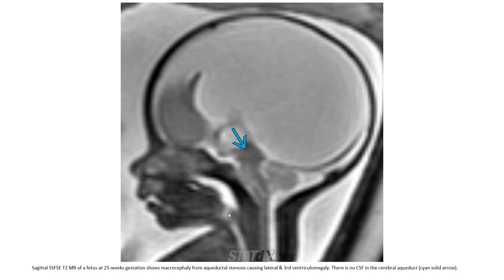This is the sagittal T2 MRI of a fetus at 25 gestational weeks. Aqueductal stenosis is causing lateral and supratentorial ventriculomegaly. There is no CSF in the cerebral aqueduct.